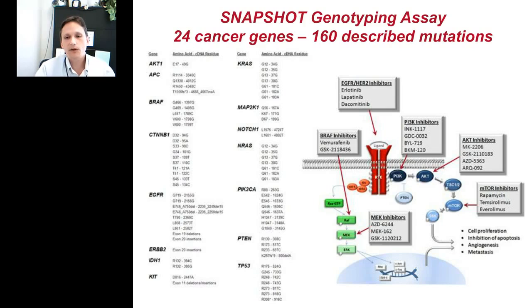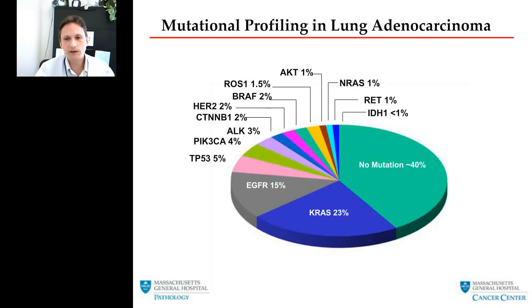So in order to move on to the next technology, we really need something that would compete favorably with something that could be done very cheaply and quickly. And so that's why we started developing the in-house AMP technology.